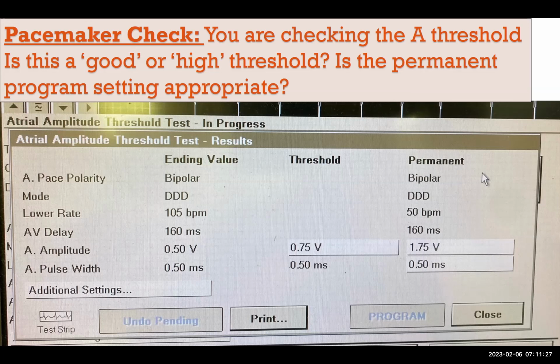Well, by how much? I guess I don't know if it's similar to the way we do our temporary pacemakers, but usually we like a minimum of 5. Well, remember that in temporary pacemakers, we're programming the amperage, but we're not programming the voltage. So that's different. You have to have both, but in temporary pacemakers, we only have control over the amperage. We don't have control over the voltage, and we don't have control over the pulse width.